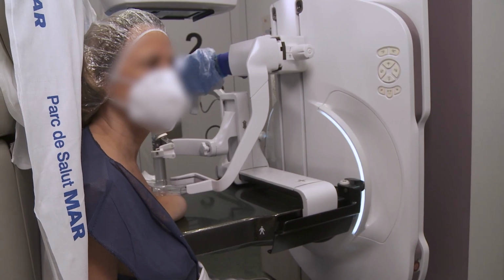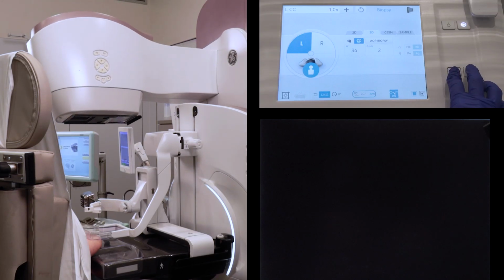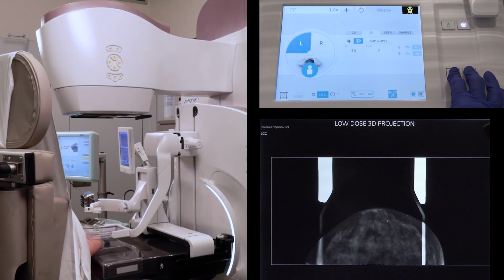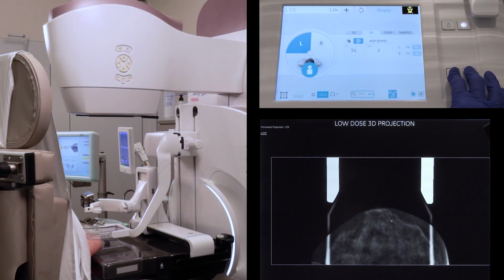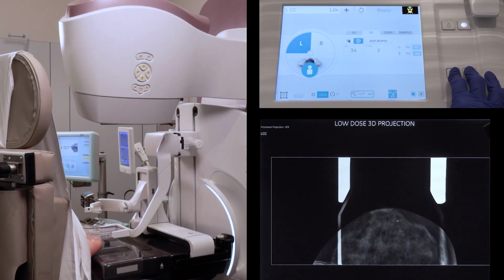The 3D biopsy exam starts. The X-ray console is set up to obtain 3D automatic optimization of parameters, AOP sequence. Exposures are performed, 3D projections displayed, followed by the preview tomo images.